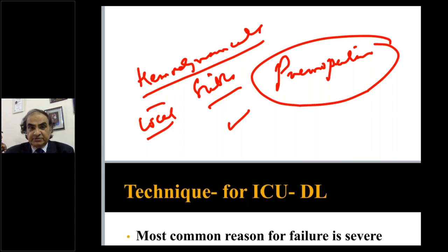In local anesthesia, you must have seen gynecologists clipping the fallopian tubes. They don't do too much dissection around. And they do it for endometriosis, taking a biopsy. I mean, little procedures can be done. So I'm not saying that cannot be done, but you should know the limitations.